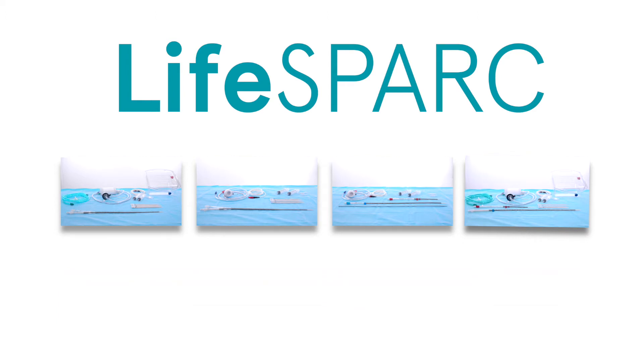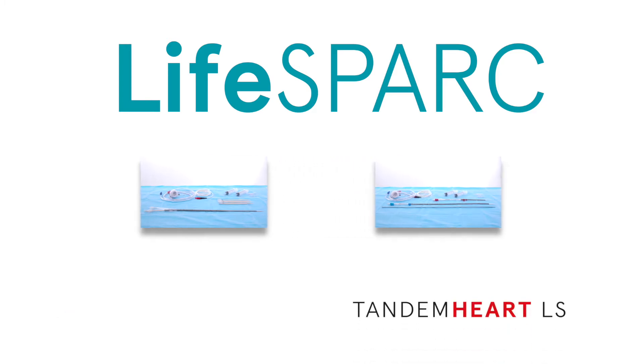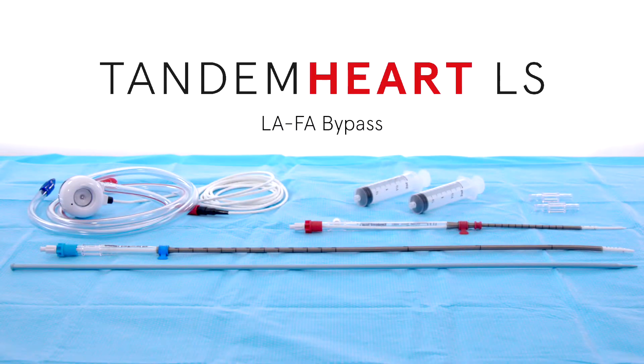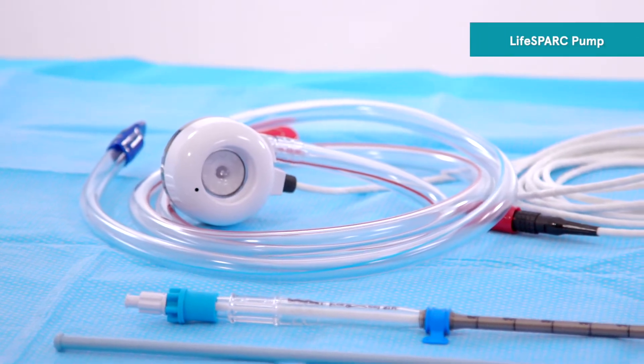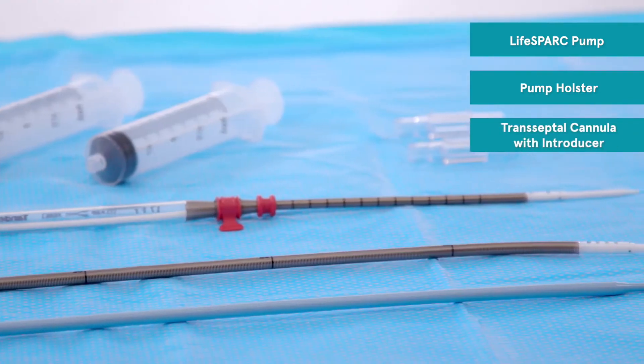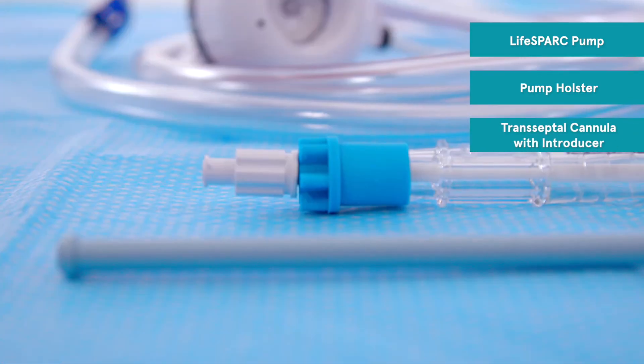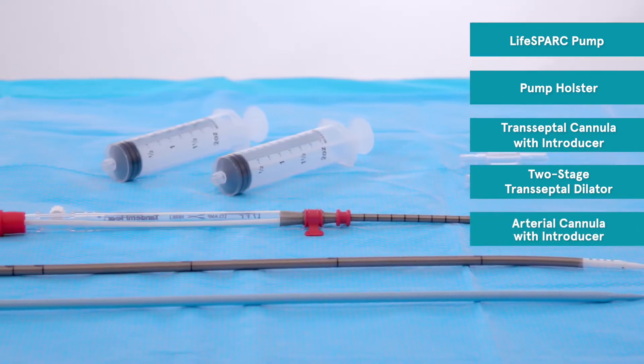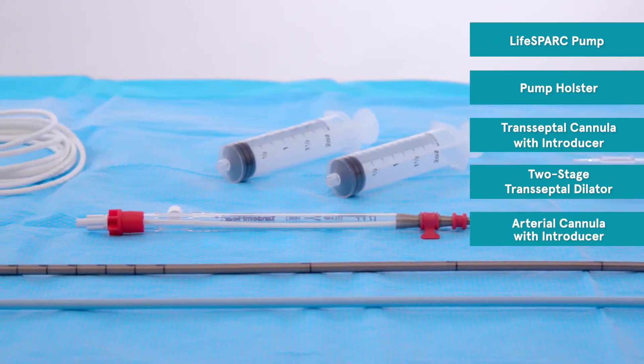Let's unbox each kit. The Tandem Heart and Protec Duo are used to provide temporary cardiac bypass support. The Tandem Heart LA-FA bypass kit includes a LifeSpark pump, a pump holster, a transeptal cannula with introducer, a two-stage transeptal dilator, an arterial cannula with introducer, and a thigh wrap.